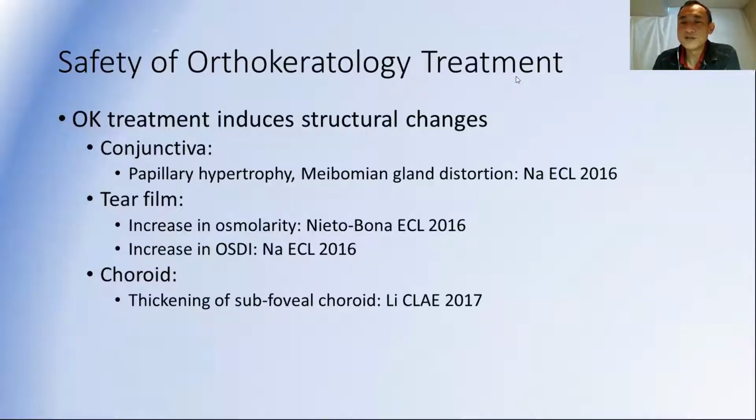I have a couple questions that have come up. How often is it recommended to put anesthetic drops? I know some patients put them in every day during 2 to 3 years. How dangerous is it? I never recommend anesthetic drops, even when I'm in the office and putting lenses on patients, because long term, if you have patients using anesthetic drops, they can cause softening of the epithelium and even melting of the corneal epithelium. And so you should never give anesthetic drops to patients to take home.